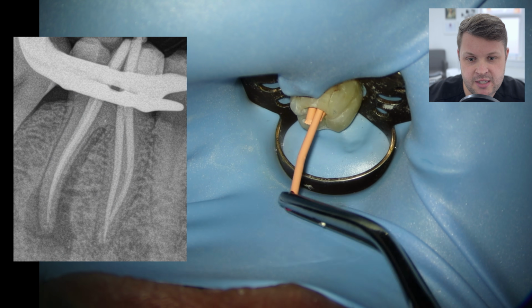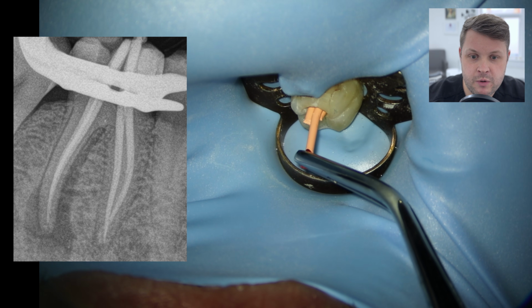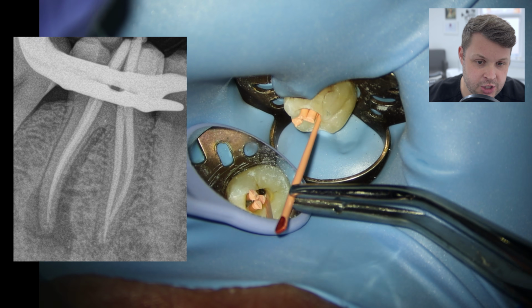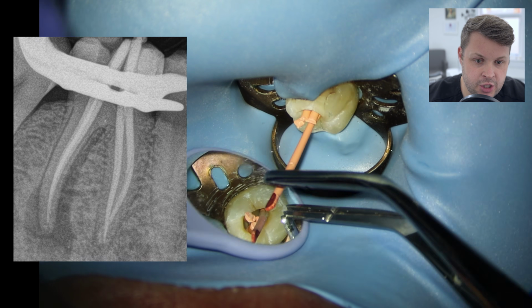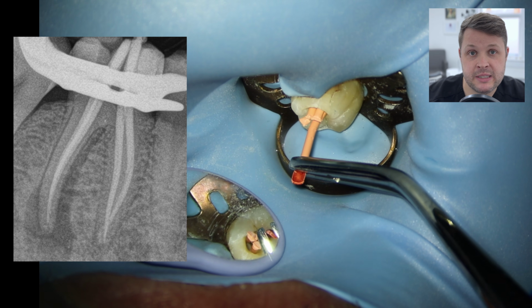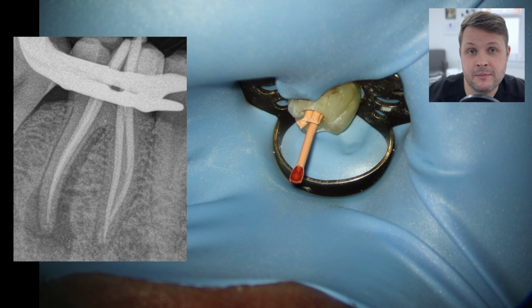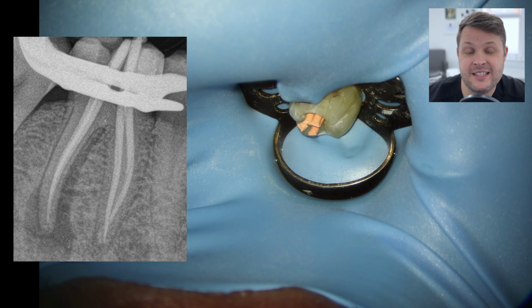So this is really, really nice. Although some endodontists might balk at this type of obturation, and what's in vogue at the moment is small preps, okay? And I suppose this is the problem essentially with high flexes. The taper is relatively large.